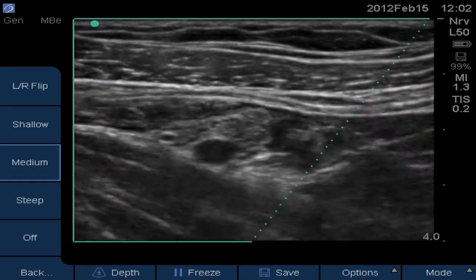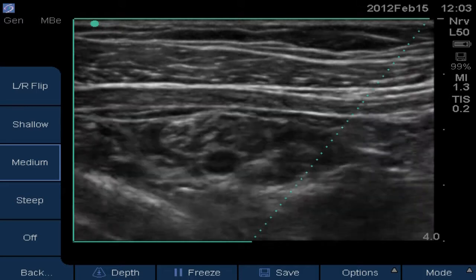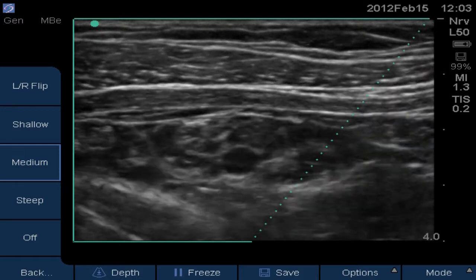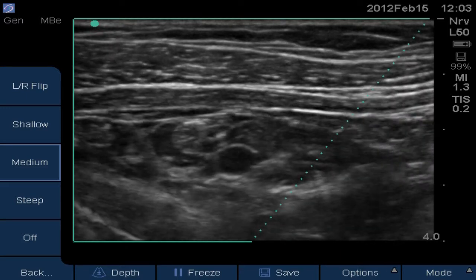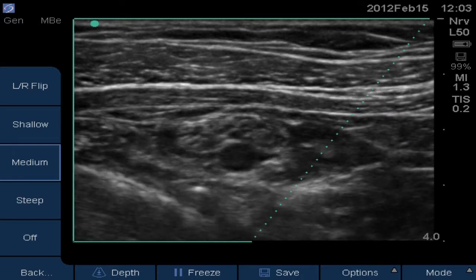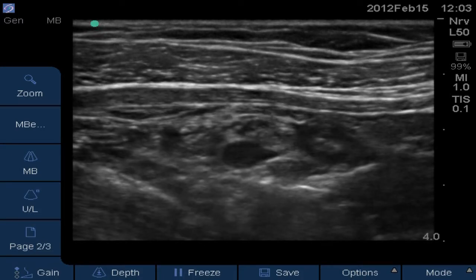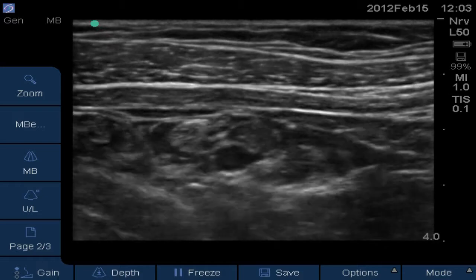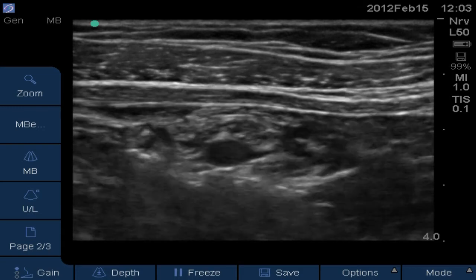See the lateral cord — some local around it around ten o'clock. Scan a little bit medial and lateral. Look around two o'clock — you can see a pretty nicely encircled medial cord. The posterior cord looks like it's been pushed over closer to five o'clock, deep to and to the right of the artery. Now turn off the visualization software — let's see if the views of the target are any different. Looks like a pretty similar ease of identification: lateral cord around ten o'clock, medial cord around two o'clock, and posterior cord around five o'clock.